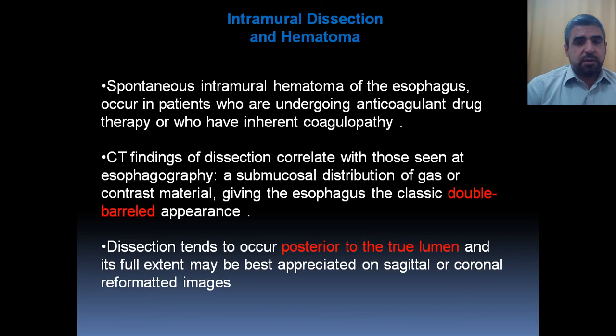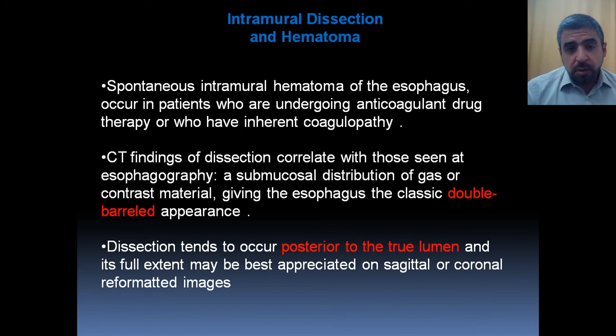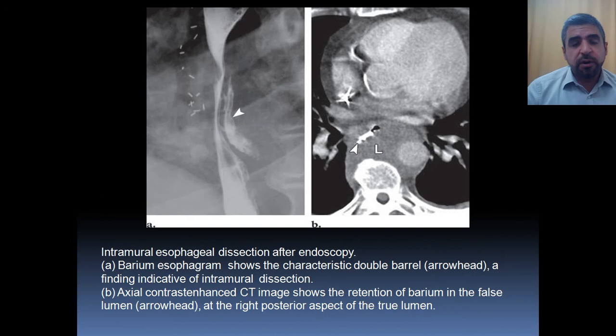Just spontaneously, without any previous injury or trauma, intramural hematoma can occur — usually there is either inherent coagulopathy or anticoagulant drug therapy. The CT findings of dissection correlate with those seen at esophagography: sub-mucosal distribution of gas or contrast material gives the esophagus a characteristic double-barrel appearance. Dissection tends to occur posterior to the true lumen, and its full extent may be best appreciated on sagittal or coronal reformatted images. For example, you can see here the mucosal line and the obvious double-barrel appearance of dissection.